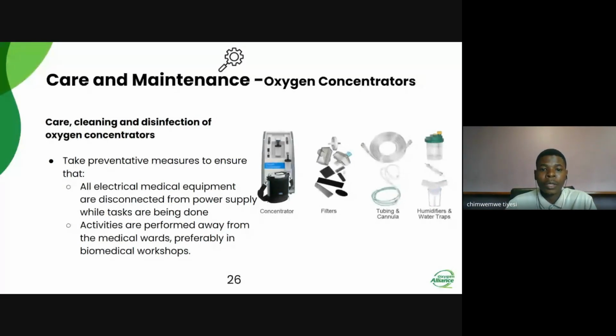Another thing is the clothes you wear when preparing disinfectant or when you are cleaning the oxygen concentrators or any other medical equipment. You need to have a face mask covering the nose and the mouth. You should also have covered working shoes, and you also need a long-sleeved, liquid-resistant gown or an apron so that you protect yourself from infections.